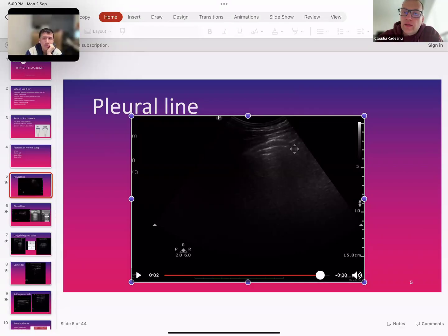All right. So underneath you see another white line, and another one. That is not a pleural line, but we're going to go through it because it's actually a mirror effect, a reflection from the lung. So the pleura is only here. Okay, and this is how normal looks. So this is called an A-line, this horizontal line.